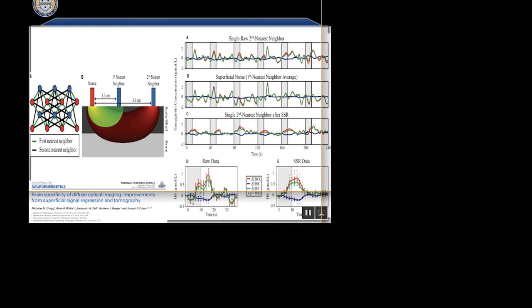I think with the NIRX systems, it's less of an issue because your wavelengths are higher, but with my system at 690 and 830 for the wavelengths, the 690 wavelength dies a lot faster as a function of distance. So they might be evenly matched here, but down here the 690 is about 3-fold brighter than the 830. So it's almost impossible to match the intensities at both distances, and that causes an issue with my systems.